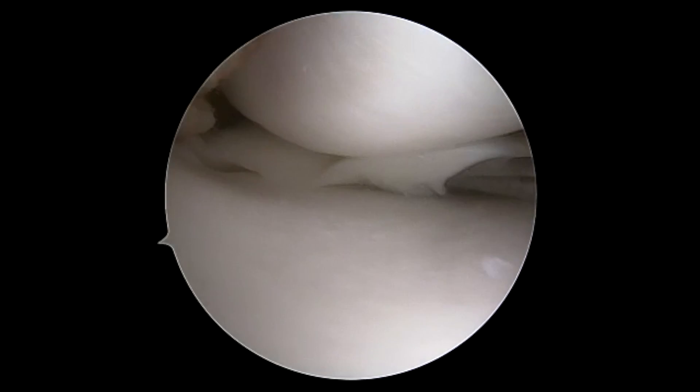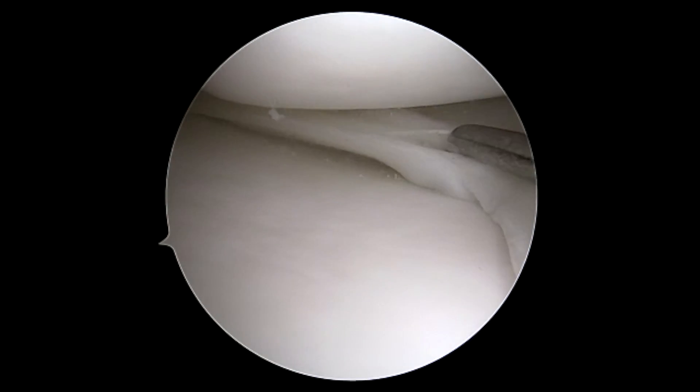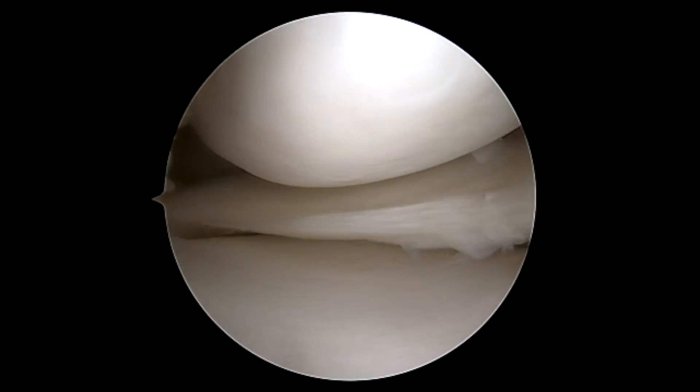Initially under scope it's hard to identify this horizontal tear. You need to remove a very small strip of the white-white junction of the meniscus to access this horizontal cleavage tear.